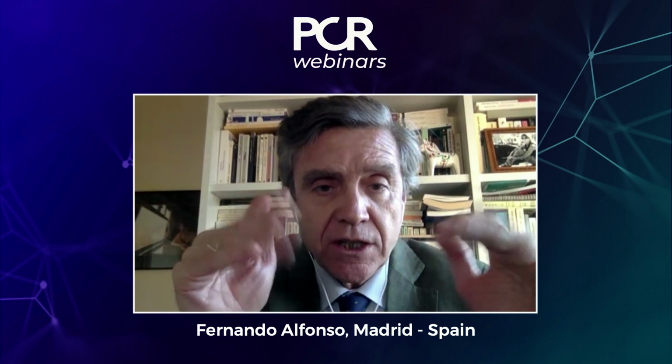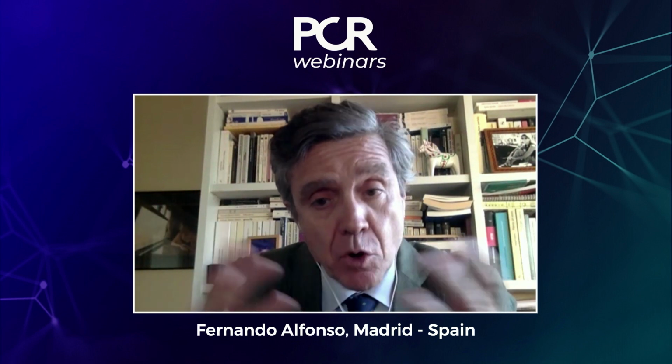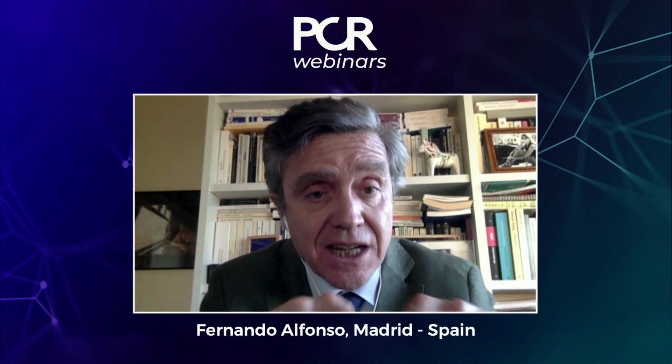Well, there are several issues I would like to discuss briefly. I mean, we got that if we do OCT in stent restenosis, you see these ugly dissections hanging within the lumen, but there is a stent. So we got plenty of information that this is healing properly at follow-up. In the de-novo lesion, using drug coating balloons, we don't have this information. I mean, there is little data suggesting how OCT can be used to optimize or to decide. If we use the criteria we use in stents, perhaps we should be a little bit aggressive, because, for instance, the dissection you left there initially, for the stent world, even at the edges, that would be meeting the criteria to stent. And that would have been a mistake because you saw a very beautiful long-term result.